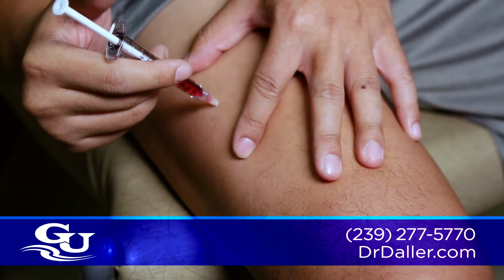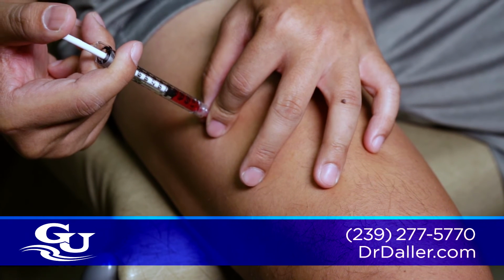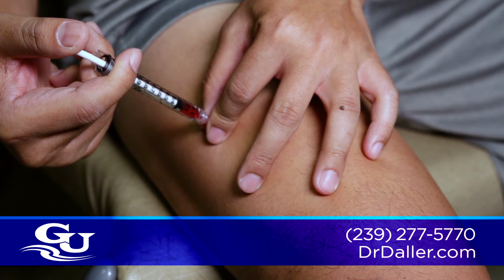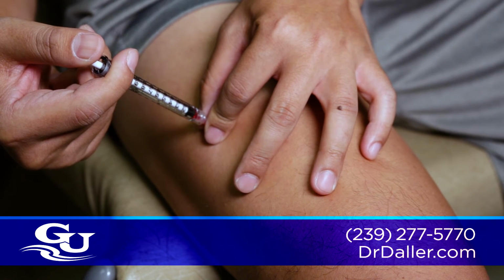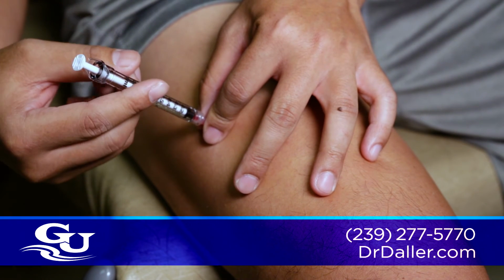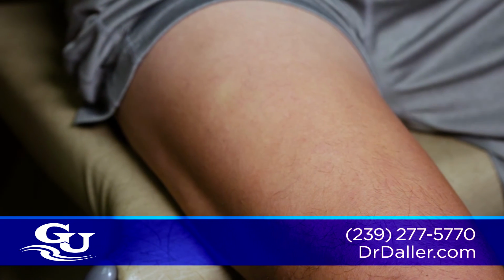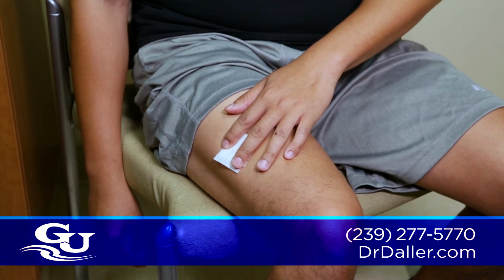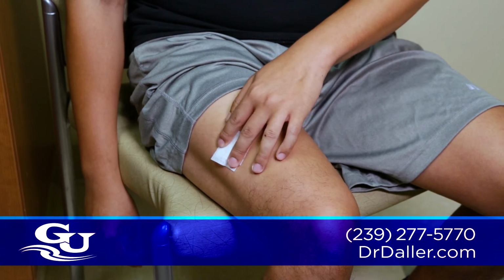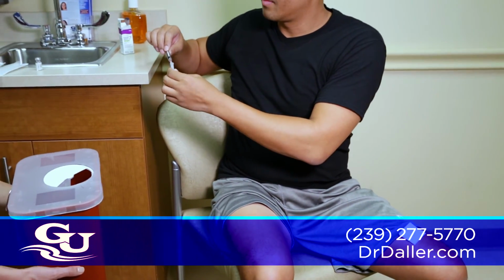Stabilize the syringe with your non-dominant hand as you inject the testosterone with the other. Normally, testosterone is thicker than B12, which we are using here, so it may take 8 to 10 seconds for the injection. Once you've injected all of the fluid, remove the needle. Apply pressure for 20 seconds, and then recap your needle and dispose of your needle in the proper sharps container.